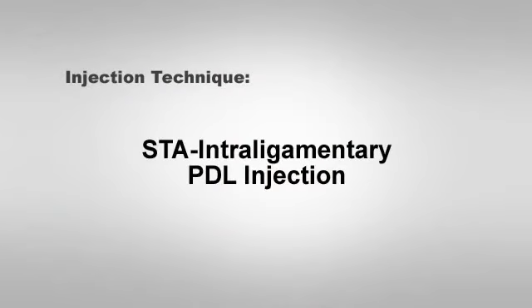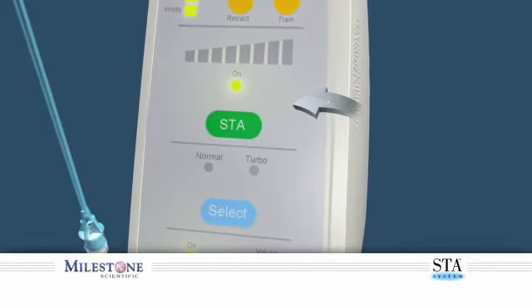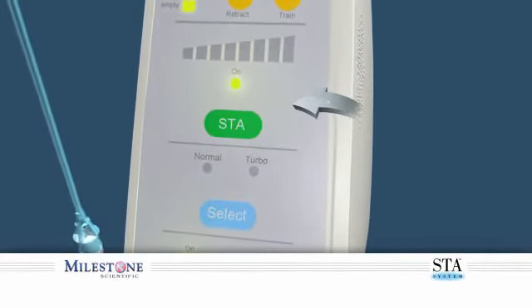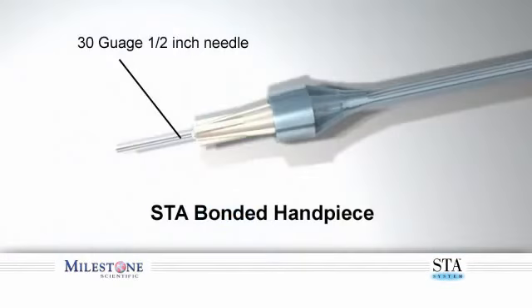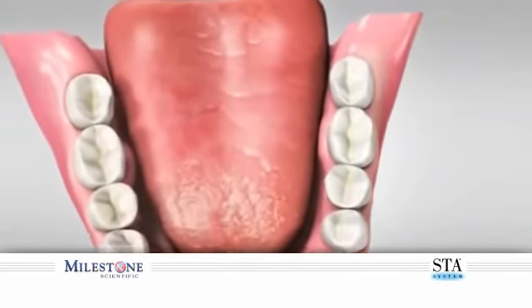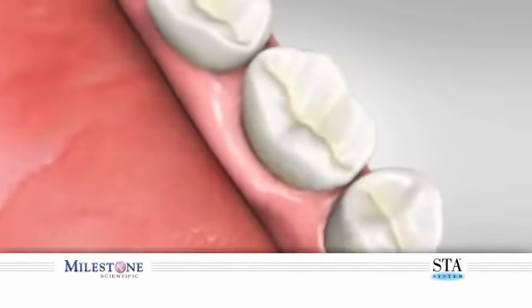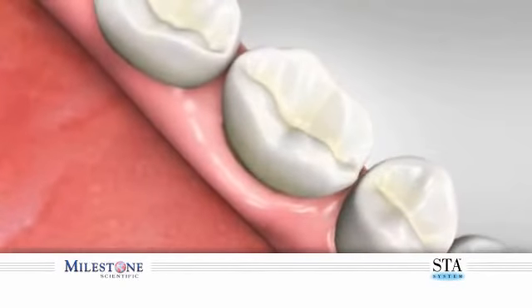Injection technique, STA intraligamentary PDL injection. Verify that the STA system is set to the STA mode. This injection is performed using the wand 30-gauge half-inch bonded STA wand handpiece. When performing the STA intraligamentary injection on multi-rooted mandibular molars, it is recommended that 2 sites be used. Always start the injection on the distal lingual root of the mandibular molar, followed by the mesial lingual root.